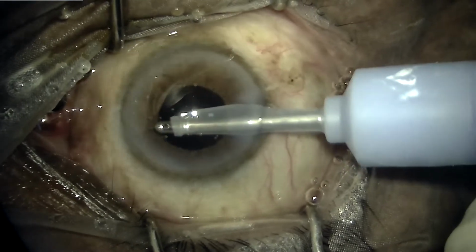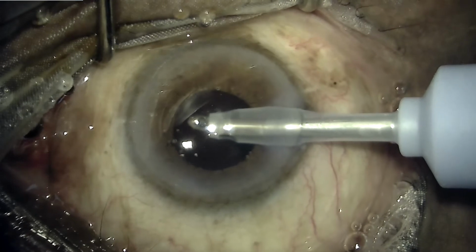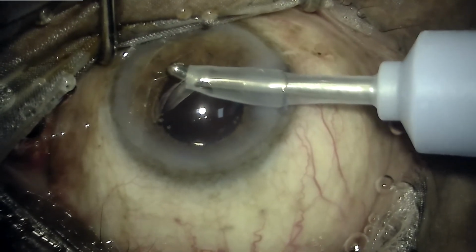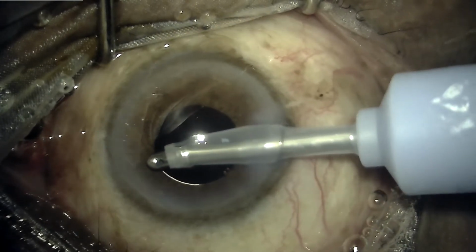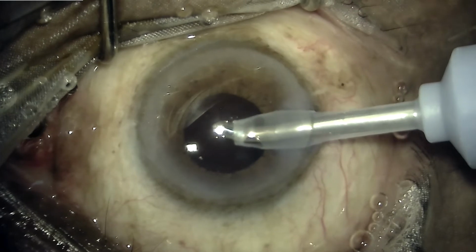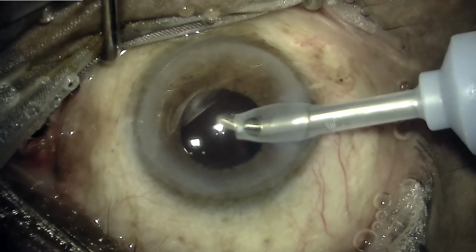I'll just remind you that this whole surgery is being done under topical anesthesia, and we can see the pupil is nice and round. There is no remnant of cortex or nucleus. Just a very small chunk has fallen down to the vitreous cavity, which I plan to observe and see what happens next.